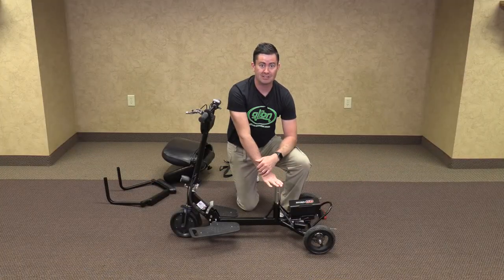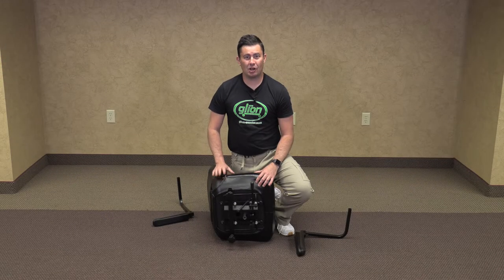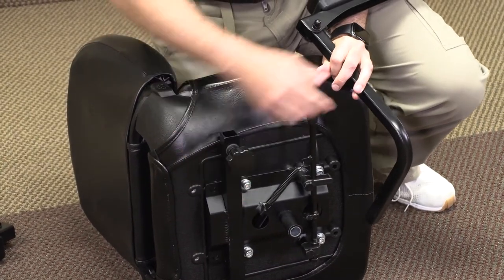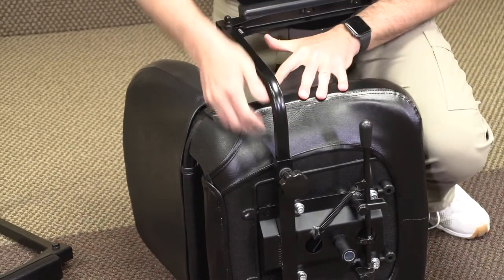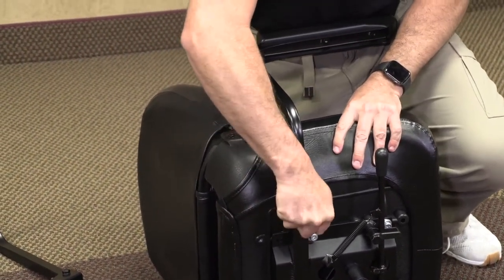Now we're ready to install the seat. We are going to install the armrest onto the seat, making sure that the armrest knob is loosened. Slide the armrest in. Tighten the knob, making sure to go about as snug as you can to hold it tight.